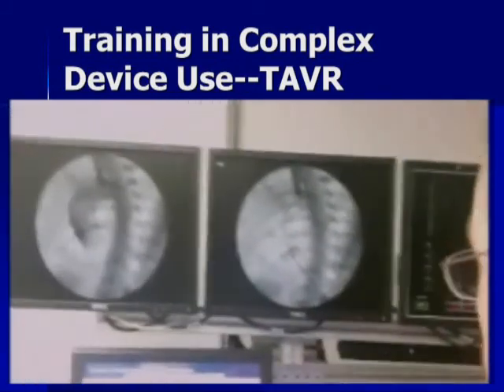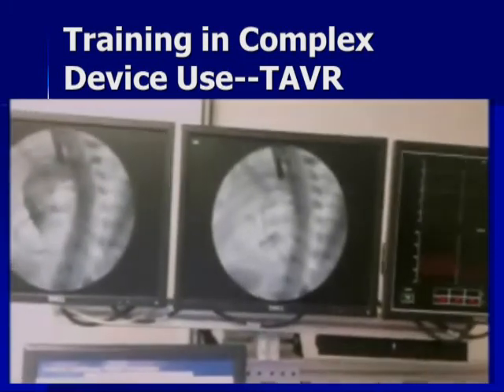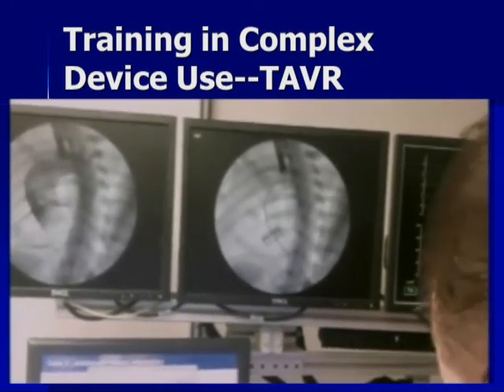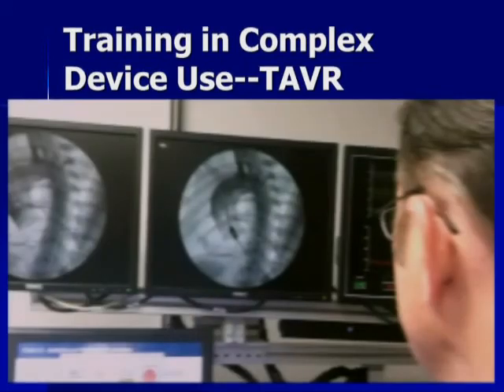What you can see now here is Joe's actually not only having to do X-ray, but he's having to do X-ray while pulling the delivery system out of the sheath. So again, this is a way to train folks on X-ray. It's appropriate steps in the deployment of these valves, wire skills, sheath skills, all with the same equipment that we're using for the commercial release and research aspects of this. I don't know if there's one more there, but I don't think so.